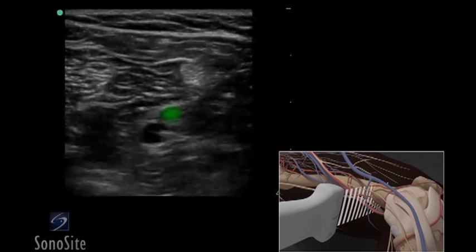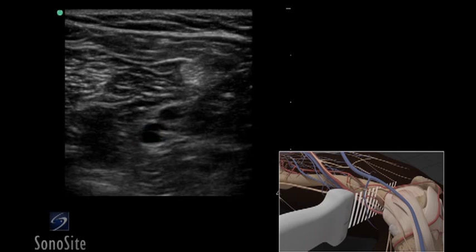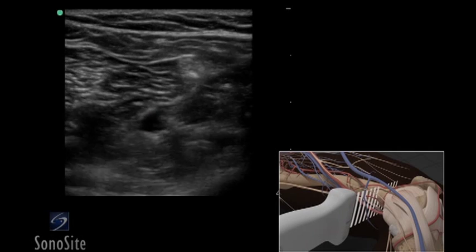From this approach, the popliteal vein will appear anterior to the popliteal artery. Repeat the compression technique.